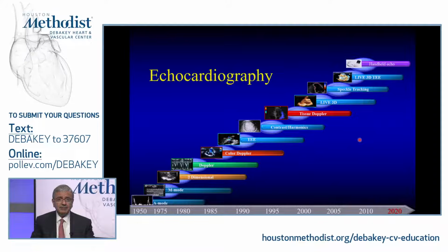But the principle is exactly the same: sending a packet of ultrasound that is reflected by the structure, and you ask basically two different questions. At least that's what we've asked at this stage of the game. One, its intensity and how far it is, to be able to localize it and get something regarding texture, etc., of the property of the myocardium or the structure.